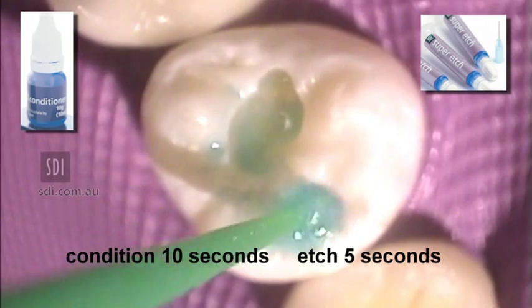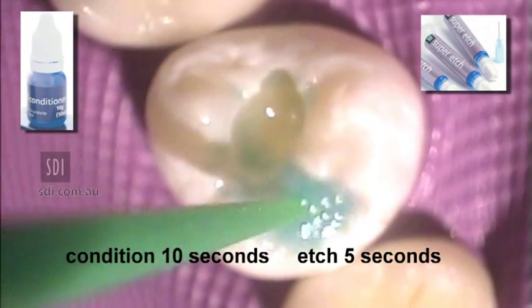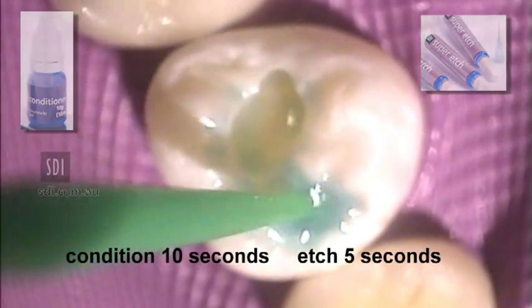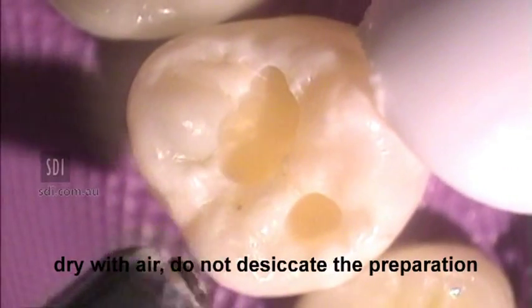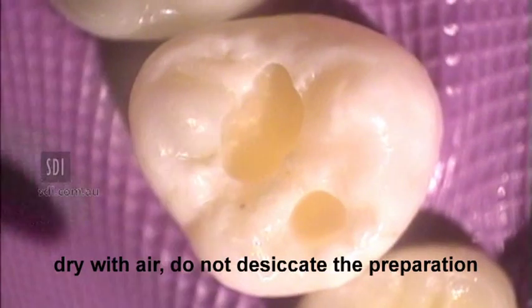Apply either Reva conditioner for 10 seconds or Super Etch for 5 seconds. Wash preparation with copious amounts of water. Remove excess water with air but do not desiccate the preparation.